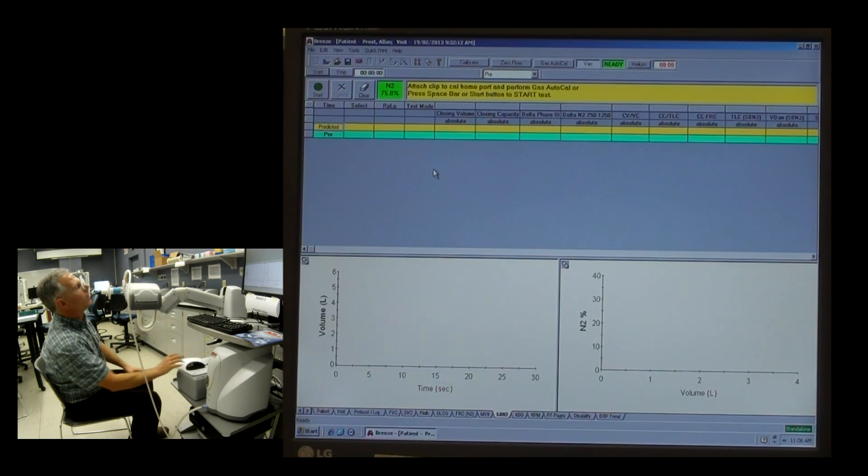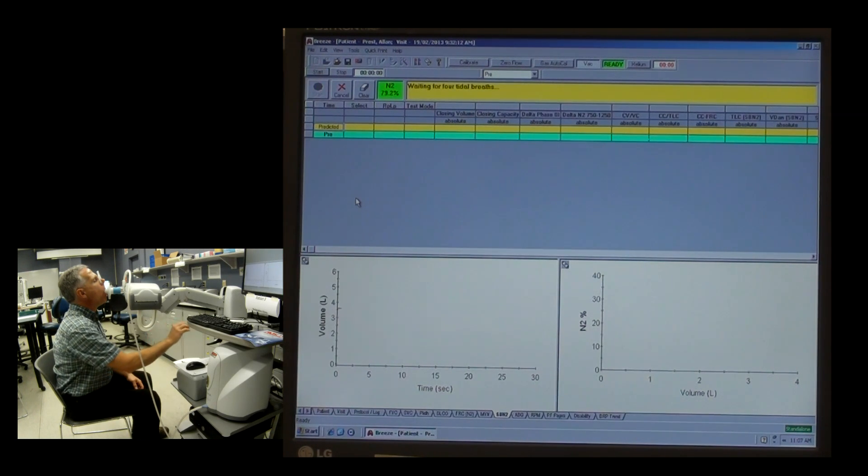So let's see what this looks like with our patient. Get them on there, just nice easy breathing, click it in. Make sure we've done our pre-gas analysis, and we want to get about four or five of those background breaths in there. That's breath number two, that's number three. And it'll give us an indication — we've got our baseline established.